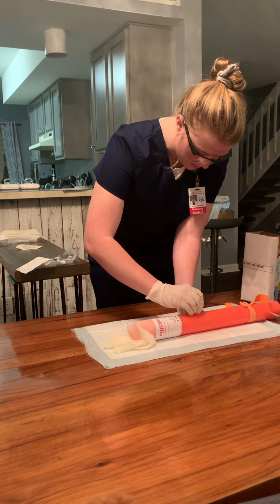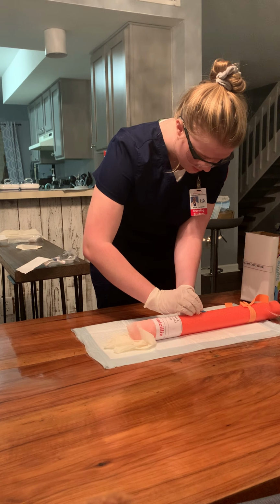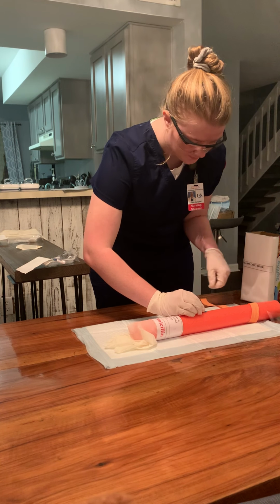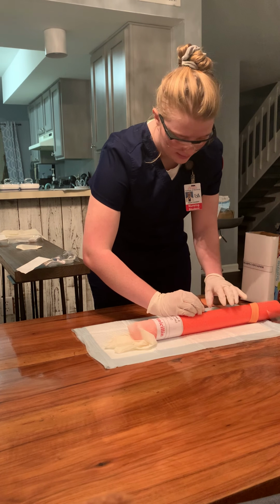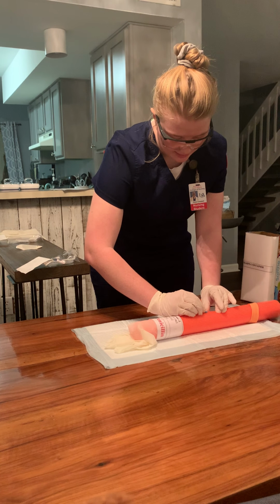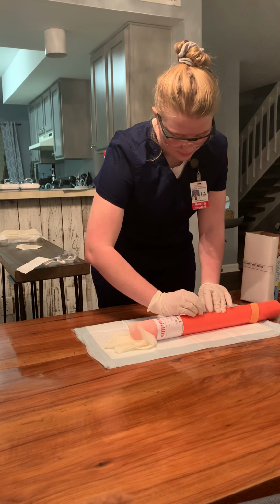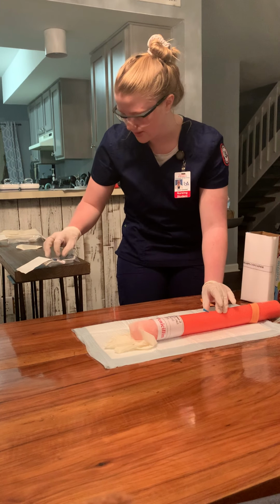And then I would advance the catheter to the hub without advancing the stylet. Secure that. And then I would apply firm but gentle pressure 1 and 1/4 inches above the insertion site. Remove the stylet and put it in my sharps container.